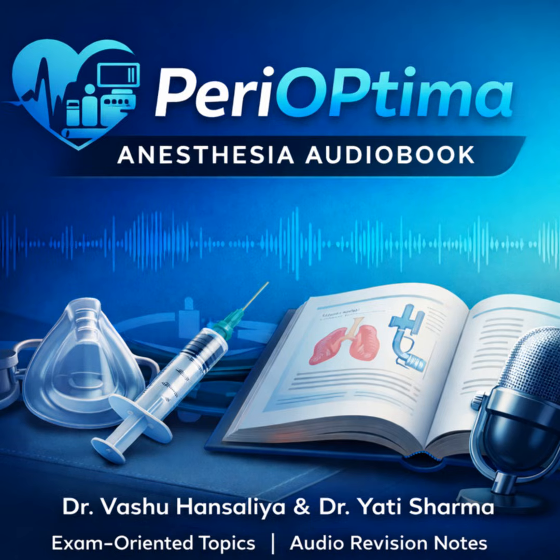Exactly. And while pressure usually correlates with volume in an O2 cylinder, a machine operating on a cylinder right near that threshold, or one that has a slow leak, can go from a safe pressure to a failure pressure with very little warning. That's why we still rely on physically looking at the flowmeters and the cylinder gauges. The pressure safeguards guard the integrity of the supply line.